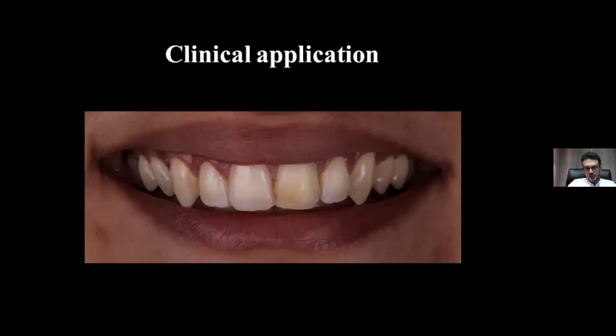Back to our cases. This is where we are going to use our protocol, the triple R protocol for intraoral characterization of monolithic restorations. What I mean by this is that after designing the restoration and after milling, you make a try-in in the patient's mouth, and then we mimic the neighboring natural teeth of the patient while the restoration is inside the mouth.